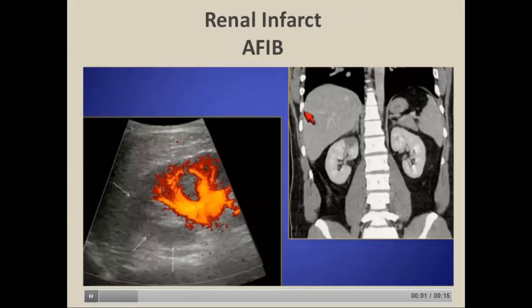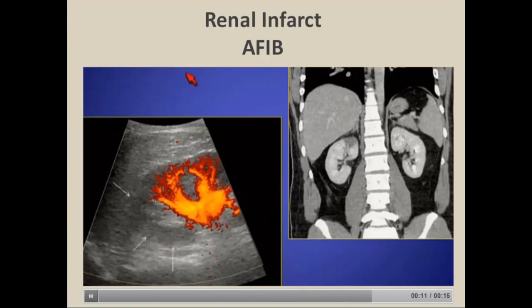Here's another example of a patient with an infarct. Power Doppler is very sensitive for tracking flow in small vessels, and you can see absence of perfusion in the upper pole. This patient had atrial fibrillation, again confirmed on CT scan.